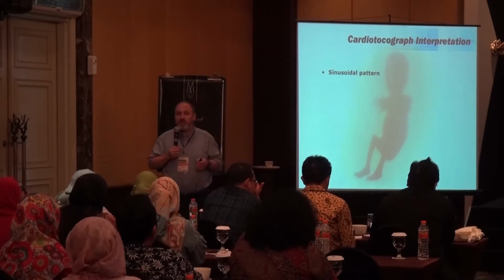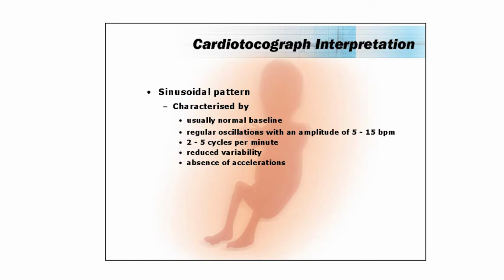Sinusoidal pattern, to use the term sinusoidal pattern. So a sinusoidal pattern is regular oscillations of the fetal heart. It's not jagged, it's not sharp, it's regular oscillations of the fetal heart. Most tracings that a midwife or obstetrician writes down, query sinusoidal, will not be sinusoidal. And those of you who are very experienced will know the difference between them. And those of you who are very experienced are probably very open to your junior staff writing down query sinusoidal. Much better write down query sinusoidal and get it confirmed than ignore it entirely.